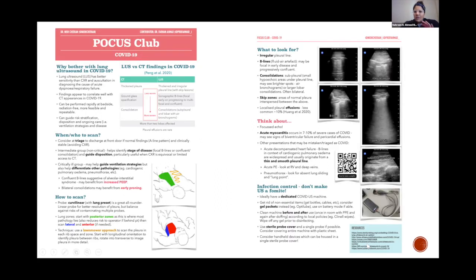So I'll just stop here. This is my last slide. It's a summary slide, really, and I'll just leave this up as we talk a little bit more.